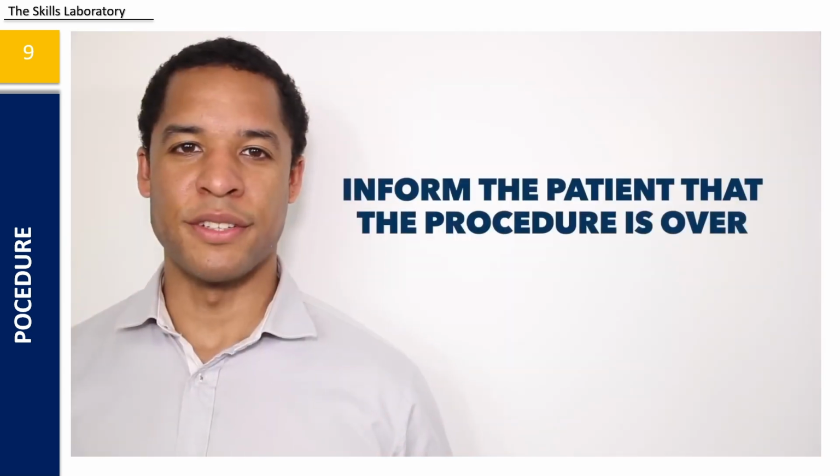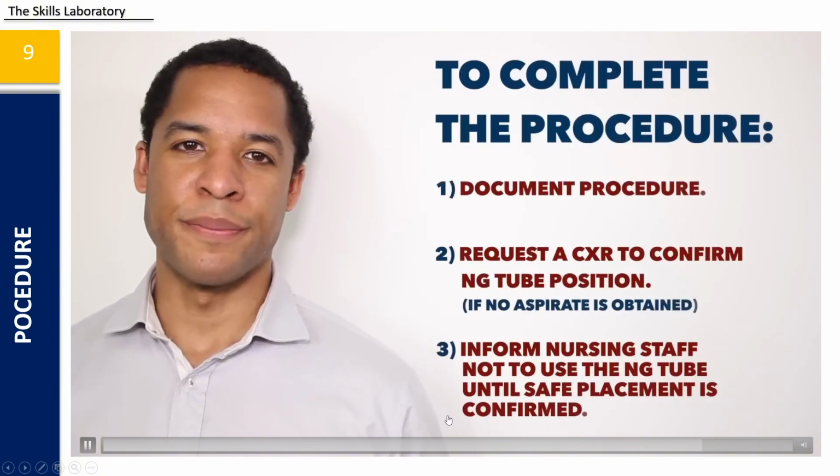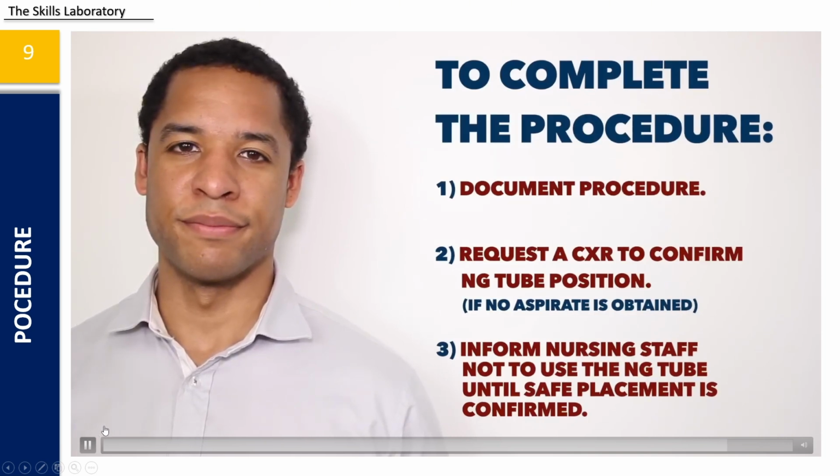I've now finished the procedure. The tube will get a bit more comfortable over the next few hours. To complete the procedure, I would order a chest x-ray to confirm the position of the tube if I was unable to aspirate gastric contents.